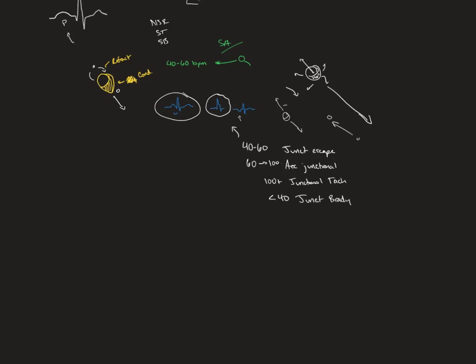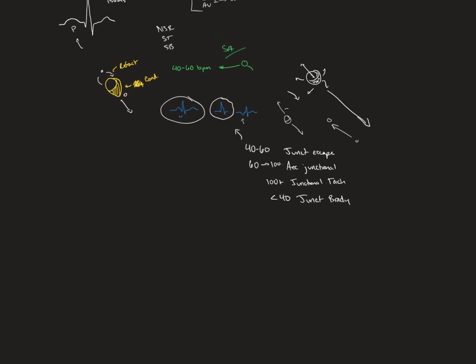So really all you're doing when you're finding these rhythms, and not like the ACLS rhythms, but like rhythms, you're looking at what does it look like and how fast is it? That's all you're doing for rhythms. What does it look like? How fast is it? So, it has a retrograde P wave in all of them. Okay, what's the rate? 40. Okay, it's a junctional escape.